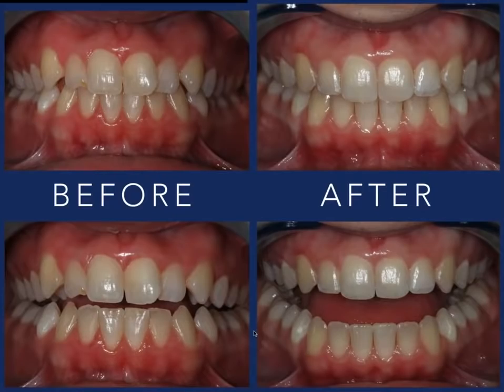And so this one was a great example of an acceleration treatment, and that was accomplished in 2.5 months. So 2.5 months with Propel and VPro 5. She obviously was highly motivated. We told her that 3 days would work here, but that she'd have to really make sure she hit that 22-hour mark with her tray wear. She did, so good for her.